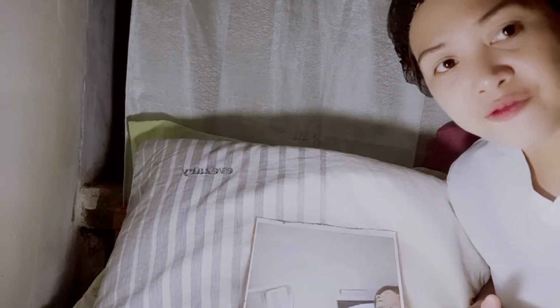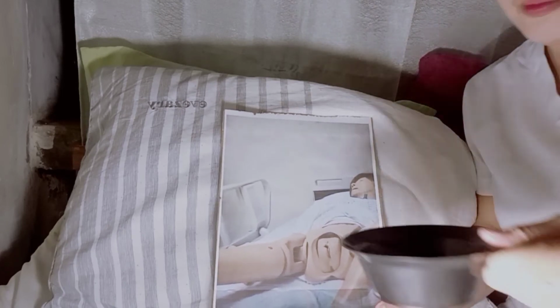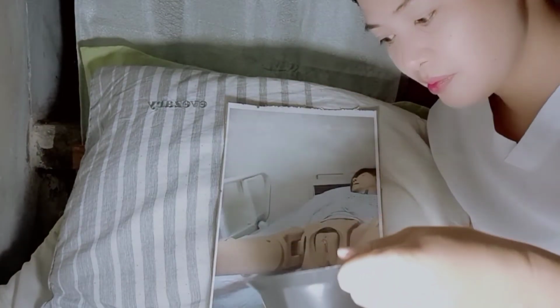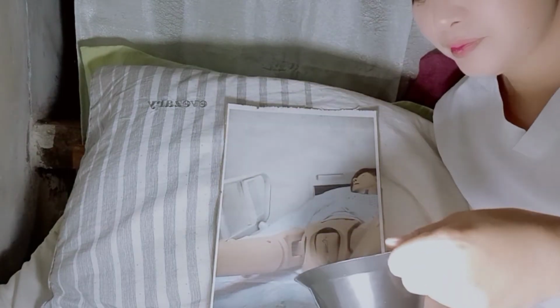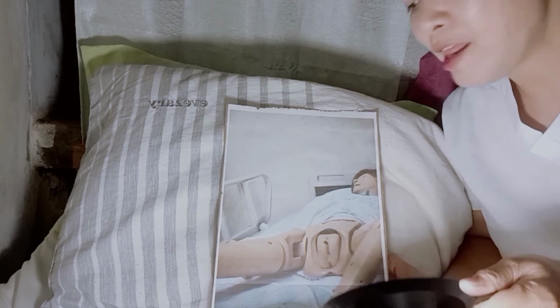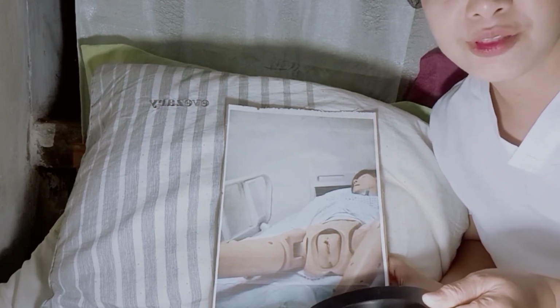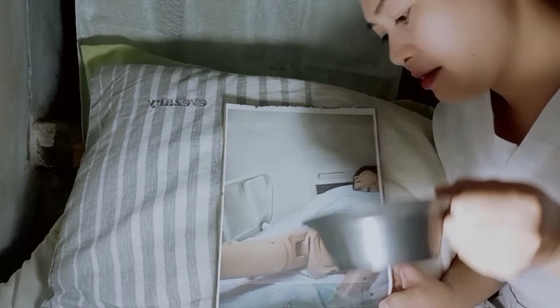Then do the perineal washing. Perineal washing decreases microorganisms around the urethral opening.